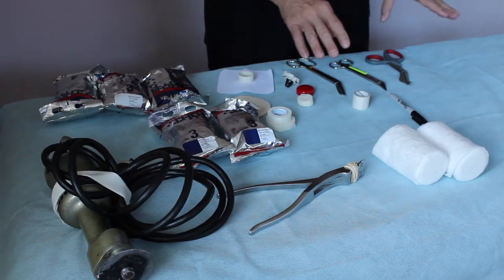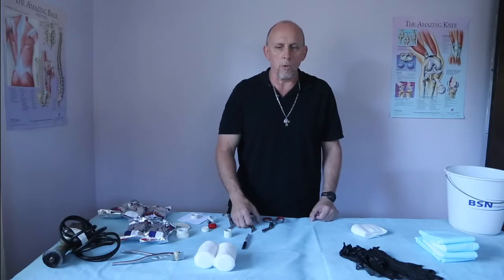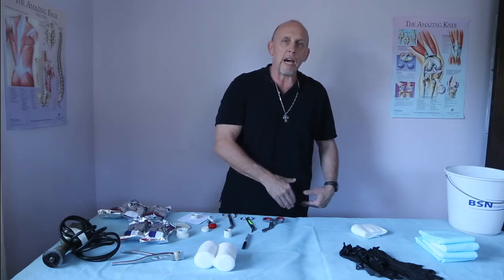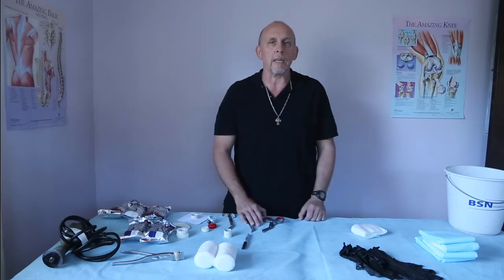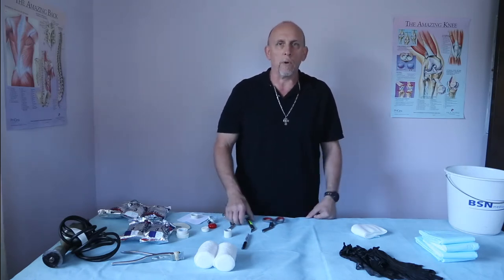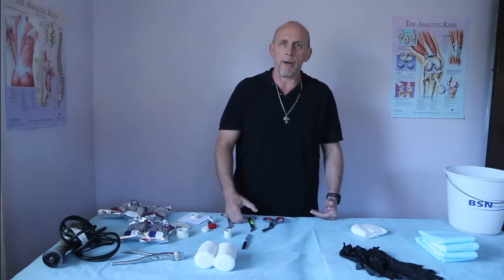Now I did show up without my foot stand today. So, like I've shown in a previous video, I'll wrap resting the foot on my thigh so the patient doesn't drop into equinus — keeping the patient at 90 degrees at all times while resting the foot on the thigh. If you ever don't have a foot stand with you, this is one technique of keeping the patient at 90 while wrapping the cast.